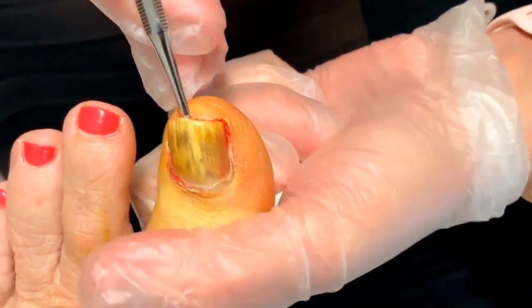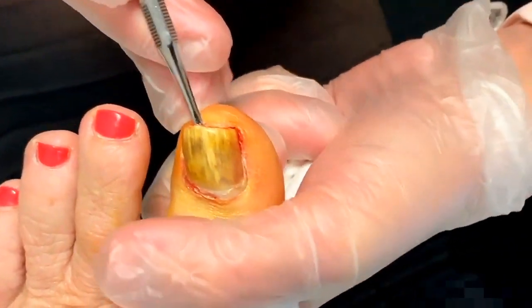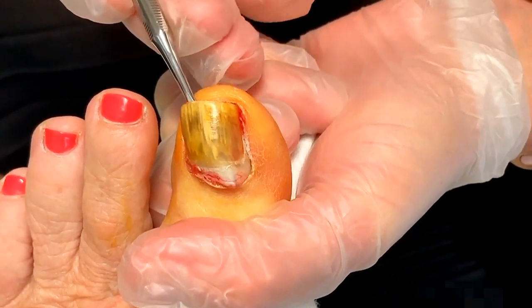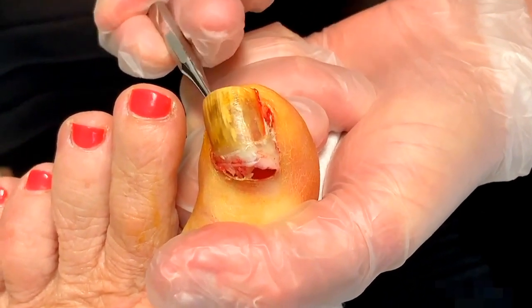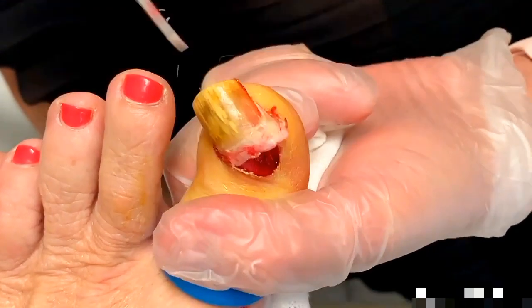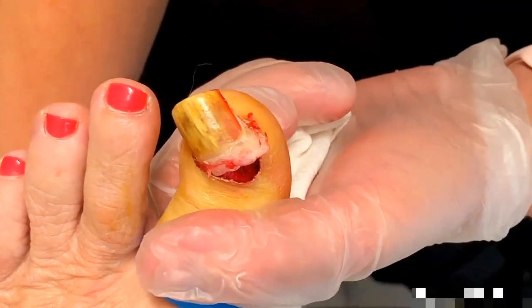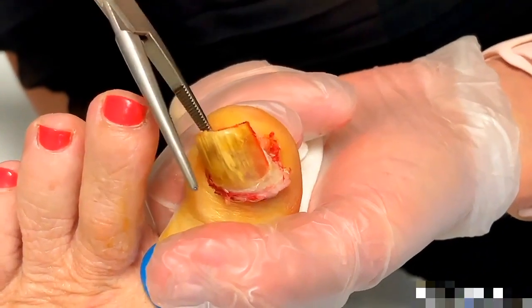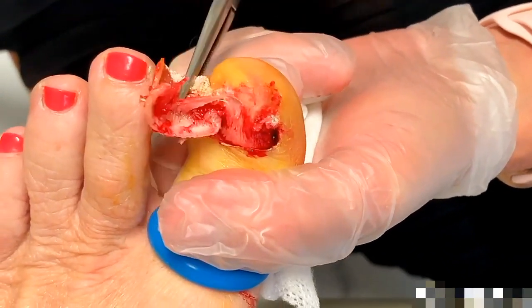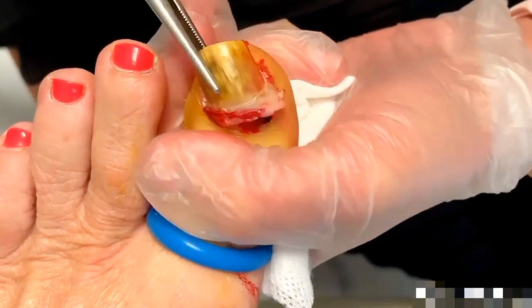What I'm going to do now is just stabilize the toe because we don't want to cause any type of fracture while doing something like this, because she's numb. And then just gently move it up. And as you can see, if you freed everything successfully, it's going to come right off. There you go — nice and simple.